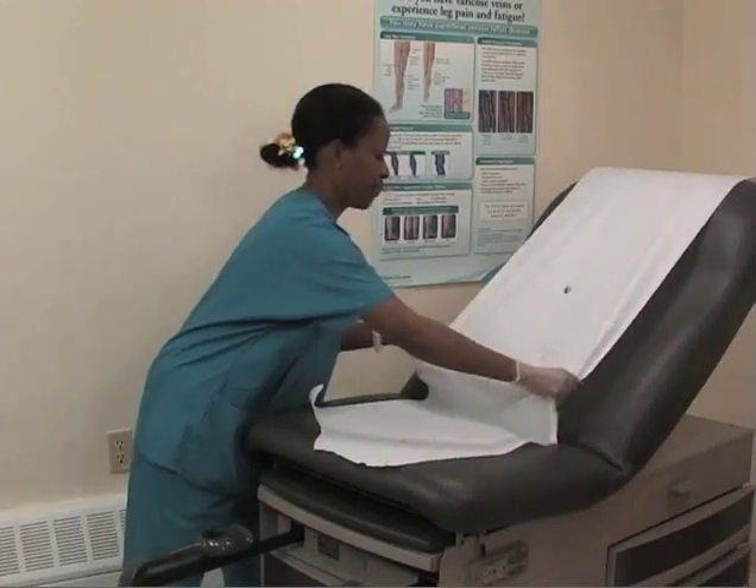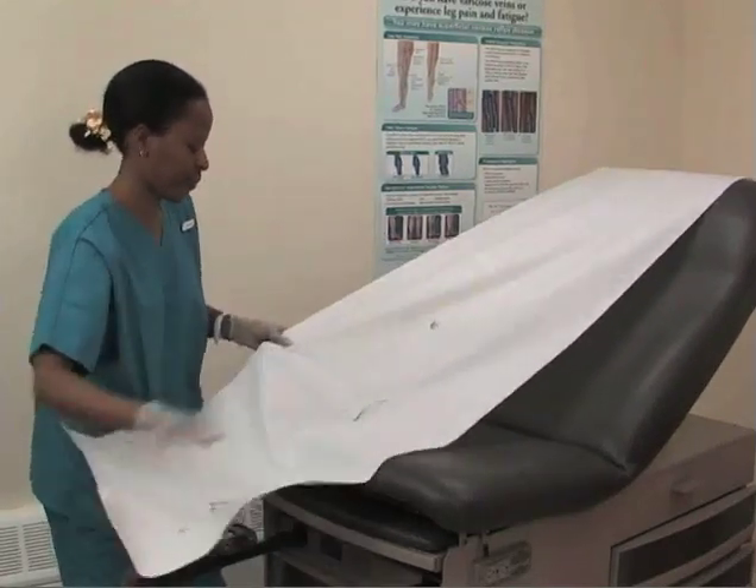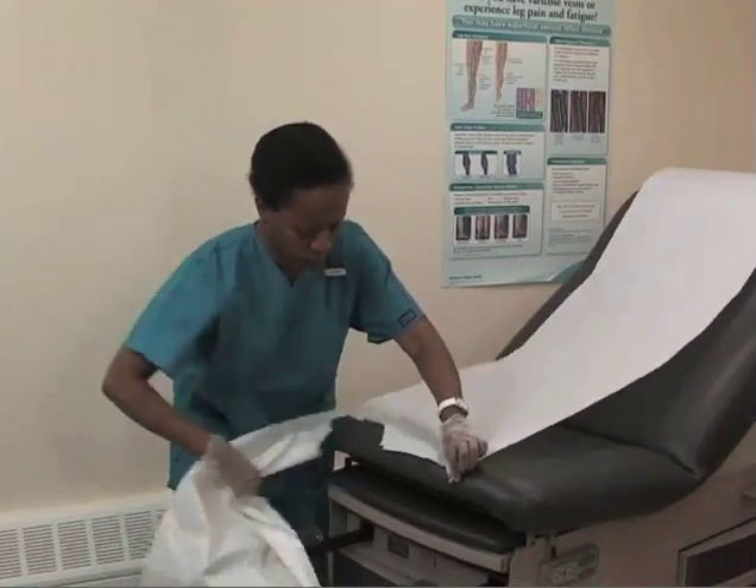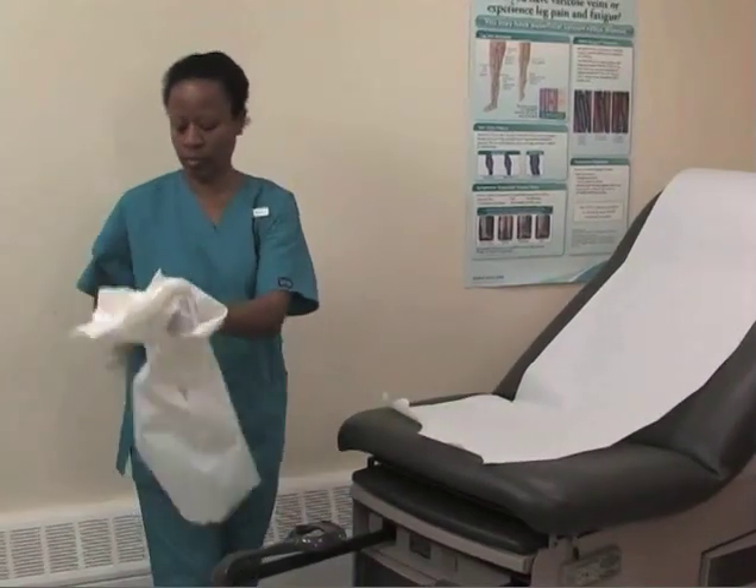While the instruments soak and after the patient has been discharged, return to the exam or procedure room and clean, disinfect, and resupply the room for the next patient.